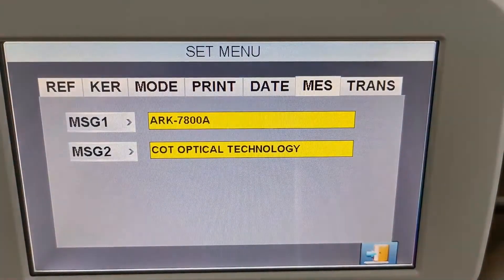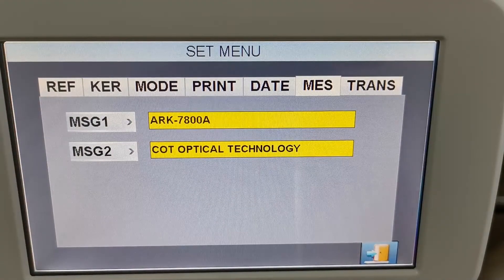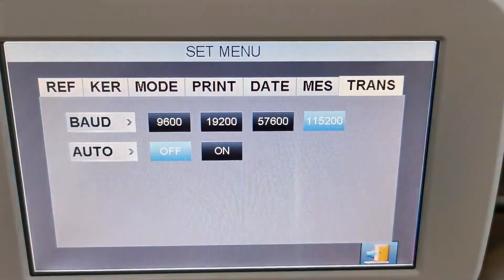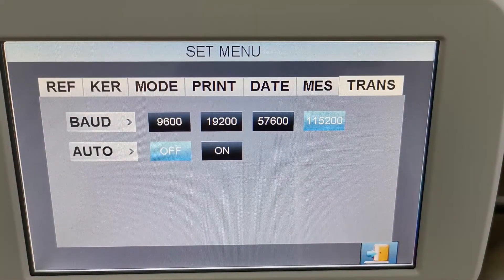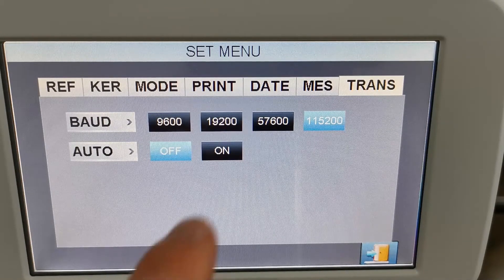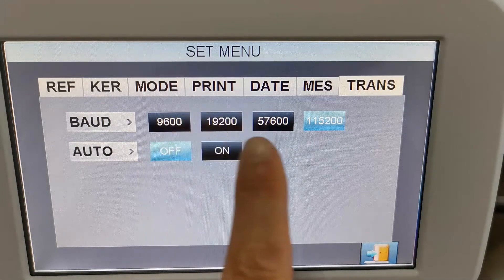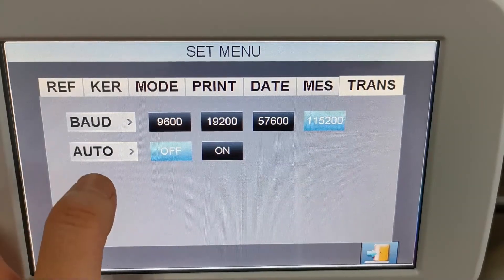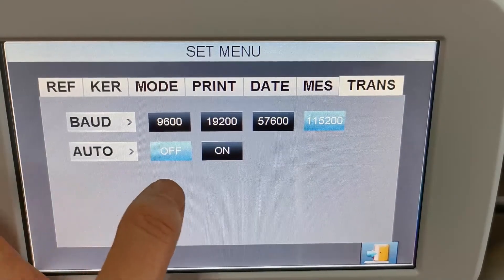Here is the message setup menu — you can set up the product model number and the shop name. Here is the data transmission setup — you can set different parameters based on different transmission modes, and it can be automatic or manual.